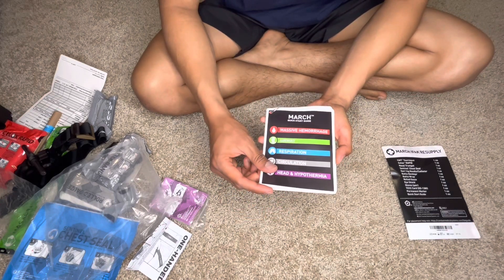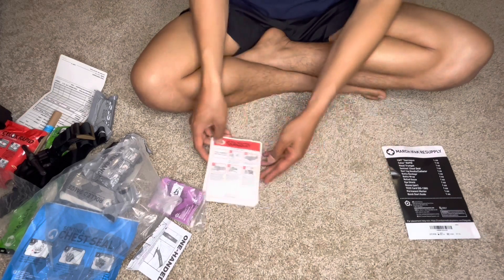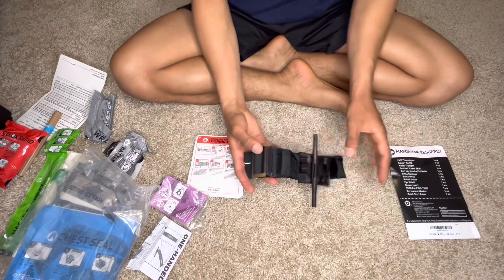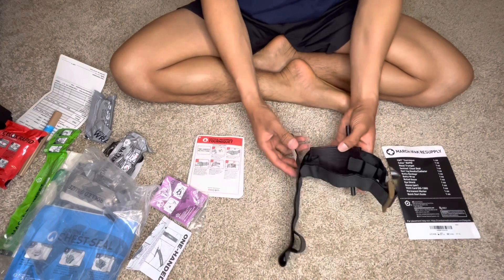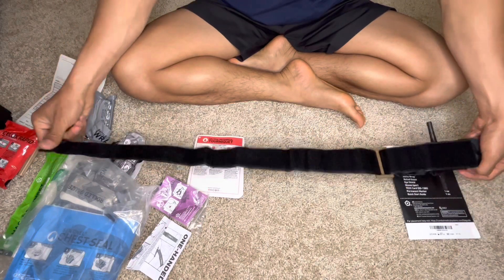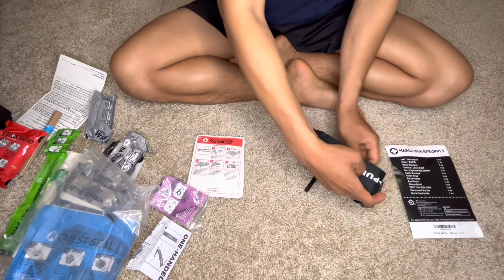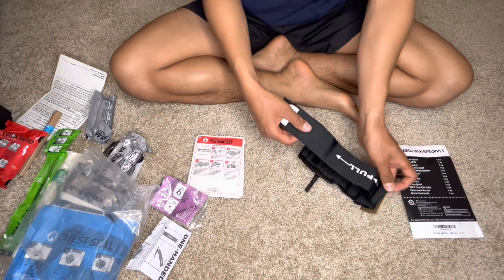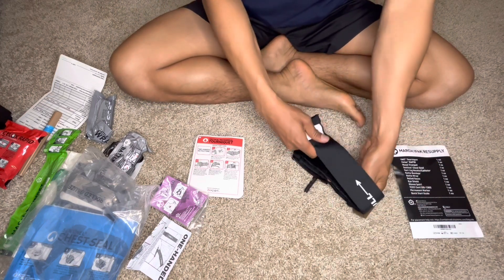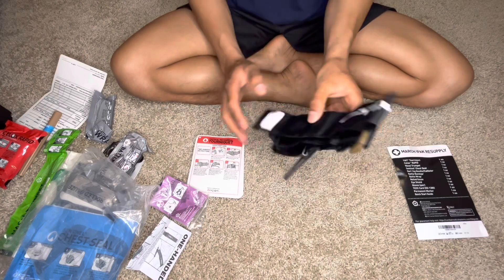First is the tourniquet. As you can see, it's thicker than before. I like to go this way — it's just my preference. This is the tourniquet.